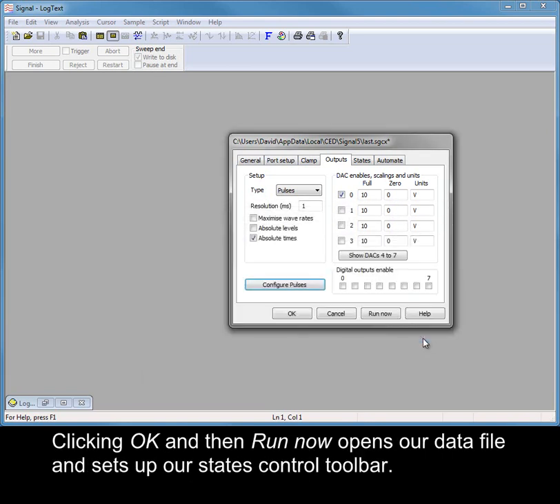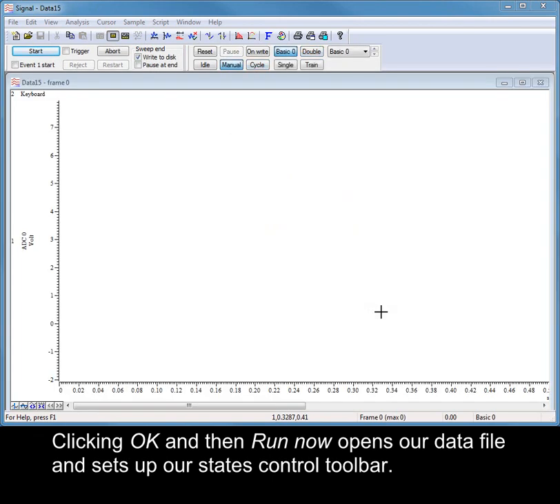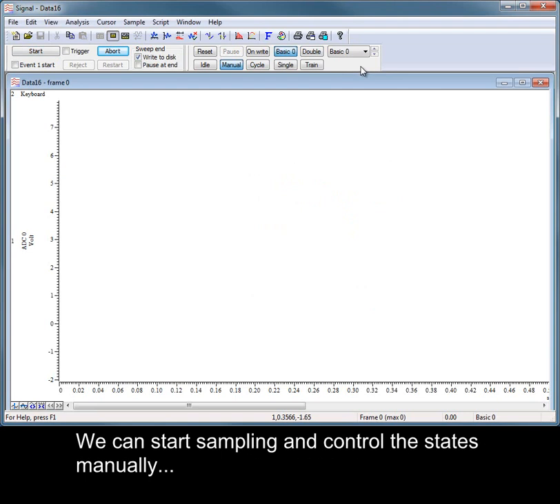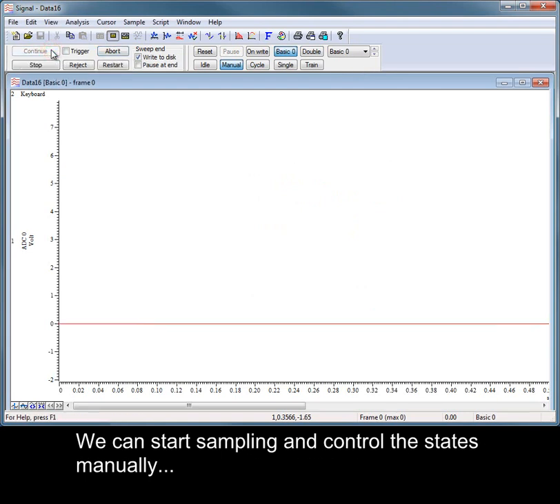Clicking OK and then Run Now opens our data file and sets up our states control toolbar. We can start sampling and control the states manually.